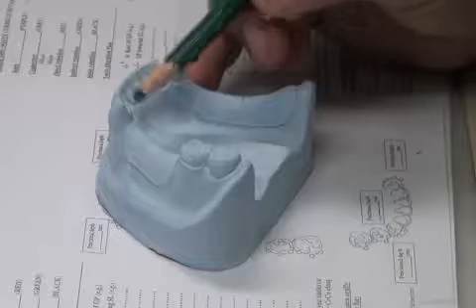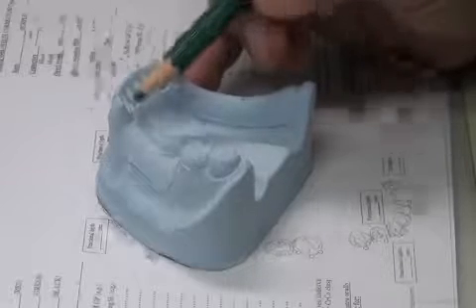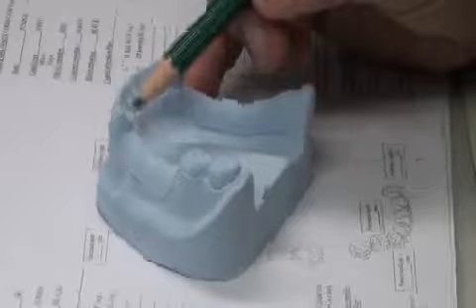Do you remember when we said preparation of the rest? We don't only prepare the rest on the tooth, on the rest area, we should make this flat, right? In the upper, the flatness of the upper part of the tooth could be done parallel to the guide plane. Okay? So try to make it parallel.